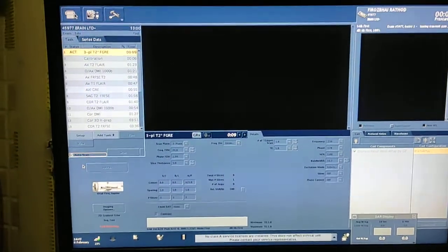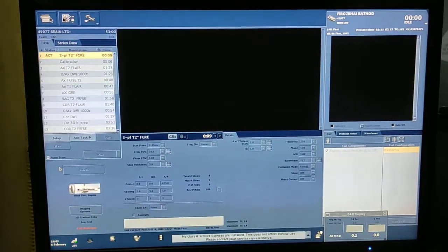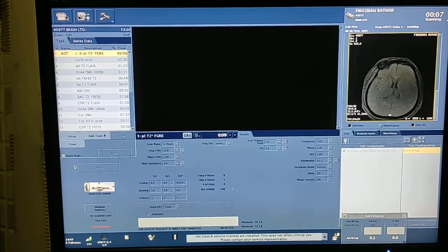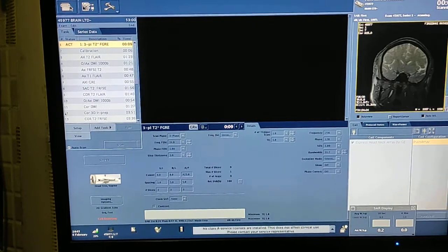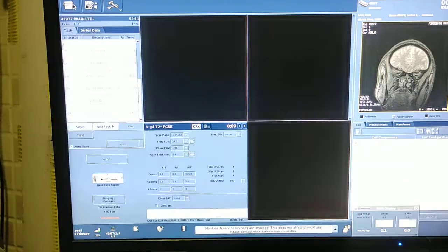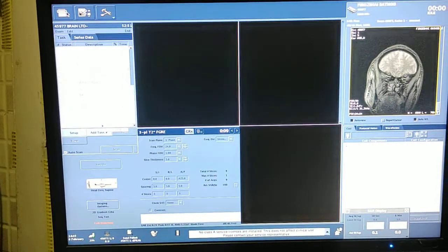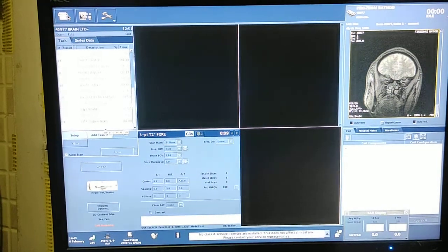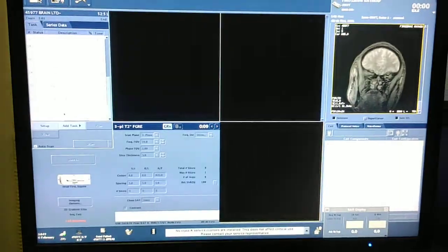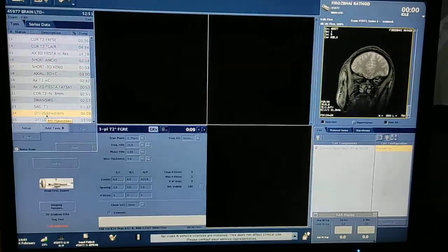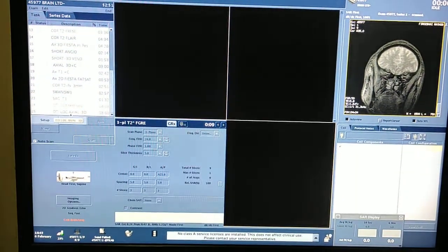The protocol is as it is — like you are scanning a full brain MRI. You only have to include one Diffusion Tensor Imaging sequence, and you should also take this 3D localizer, which is an SPGR sequence. So I have added two sequences: first is DTI 25-direction, and second is localizer 3D.